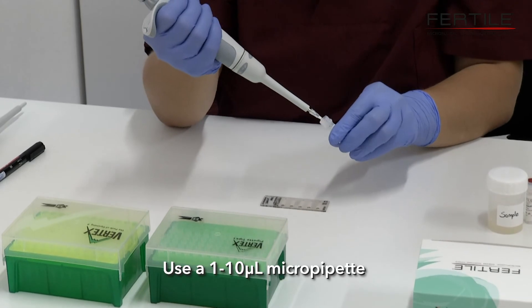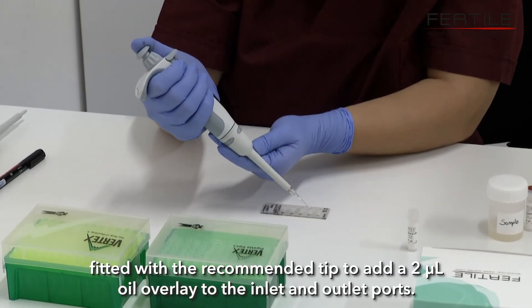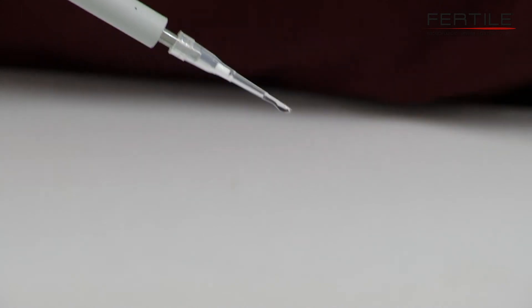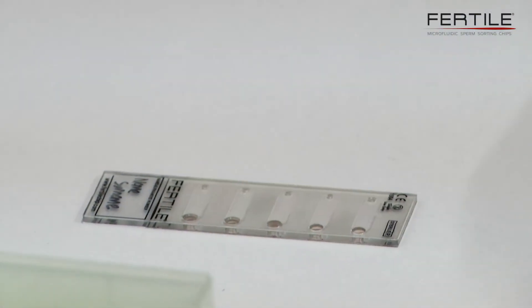Use a 1–10 µL micropipette fitted with the recommended tip to add a 2 µL mineral oil overlay to the inlet and outlet ports.